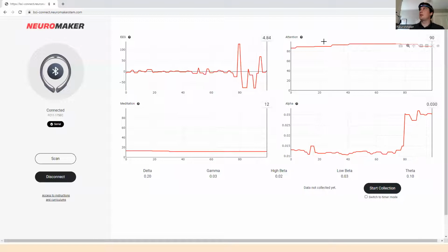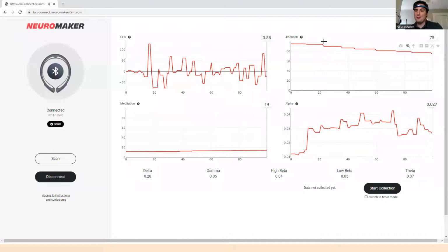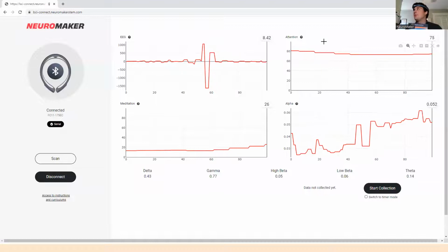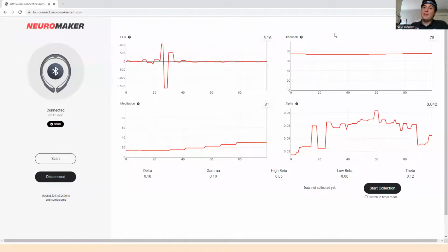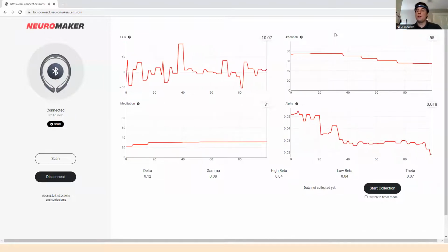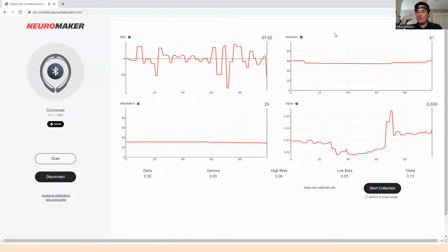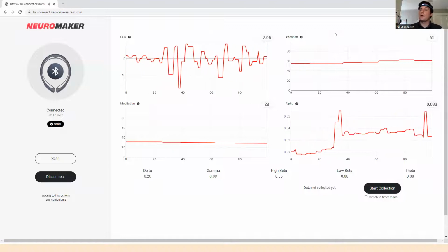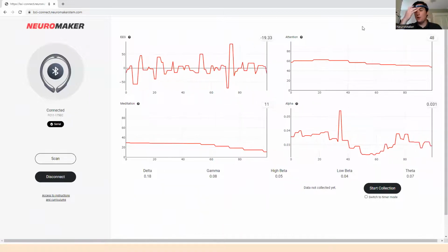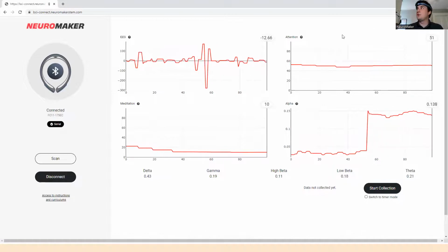Okay, so let's take a look. Whoever mentioned reading and focus, that was a pretty good example, right? So I'll uncover some of the weeds behind that now from our neuroscience standpoint. One of the things that we like to talk about with this kind of algorithm is that it's really measuring what one can interpret as cognitive energy. If you're expending a lot of mental work to do something, this algorithm is tailored to go up, because your brain, as I mentioned before, is going to give off those special electrical signals that can be captured, and then we can interpret that using this kind of a model.